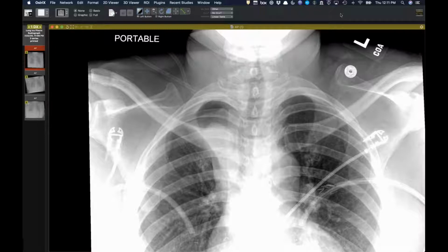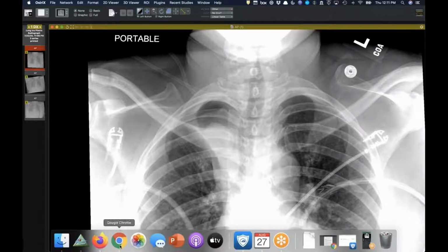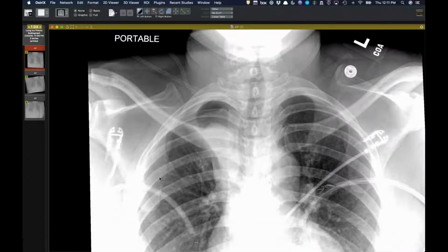Yep, I have. It just seems like, particularly in the context of placement of endobronchial valves as emphysema treatment, in which the bronchi in the left upper lobe were closed by the valves. So I've seen it on the left side twice in that context. Okay. Yeah, I think so, it's also important.